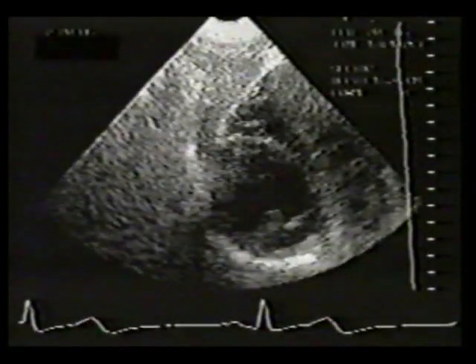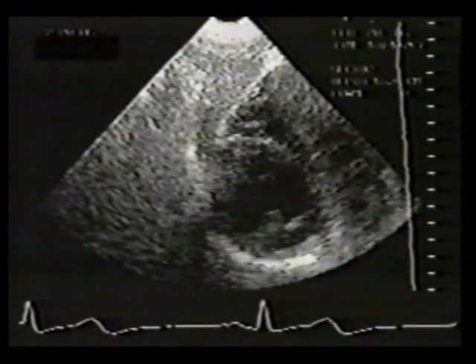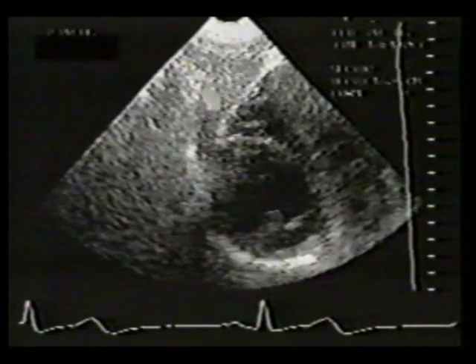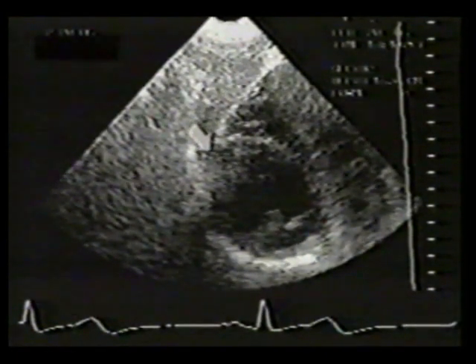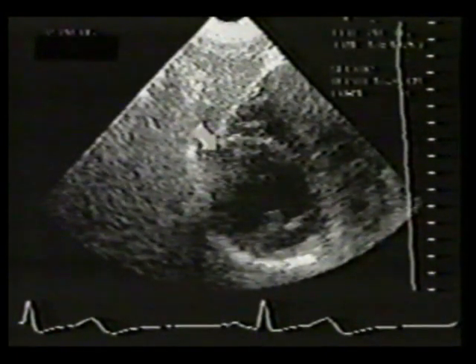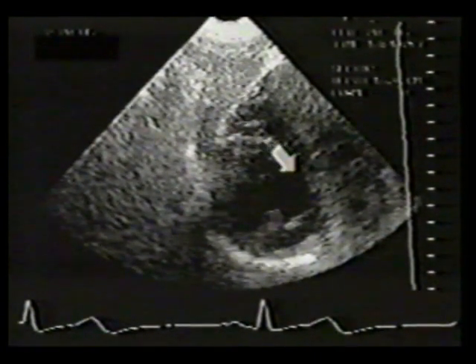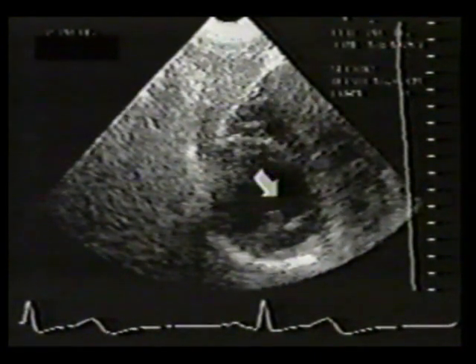The transducer has now been rotated to the short axis orientation, and the tip of the transducer has been tilted toward the apex. The ventricles can be inspected at the papillary muscle level. This is analogous to the peristernal short axis view, but the image is rotated clockwise on the screen. This is the ventricular septum, separating the right and left ventricles.